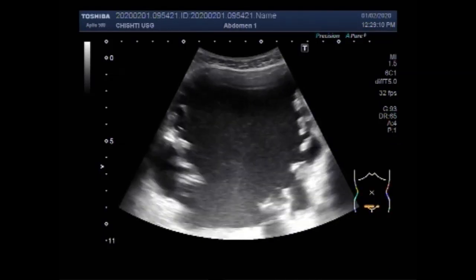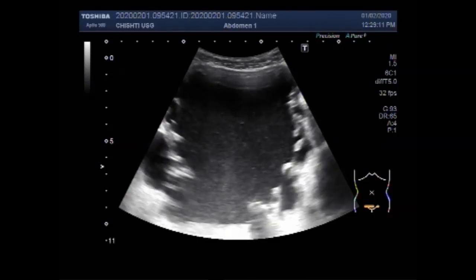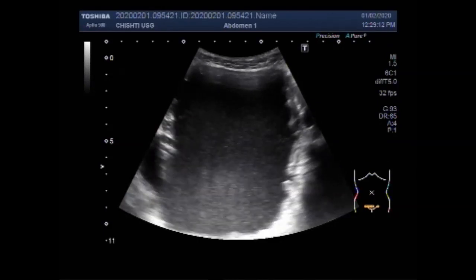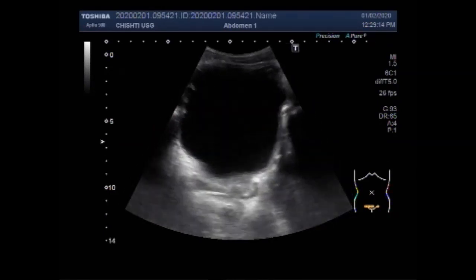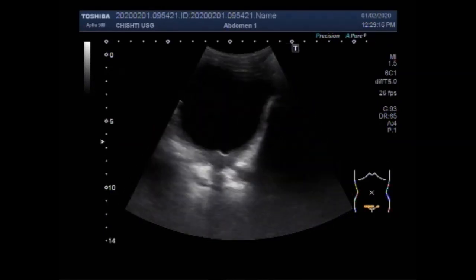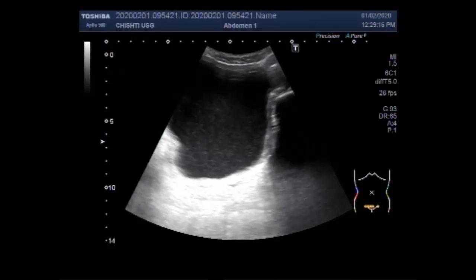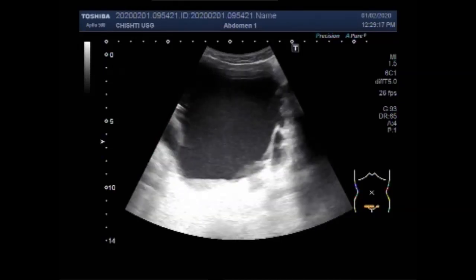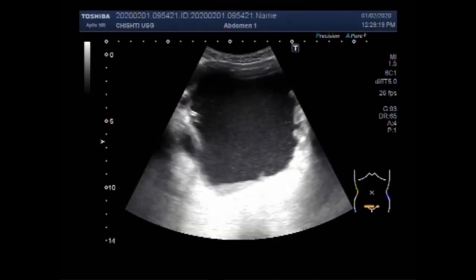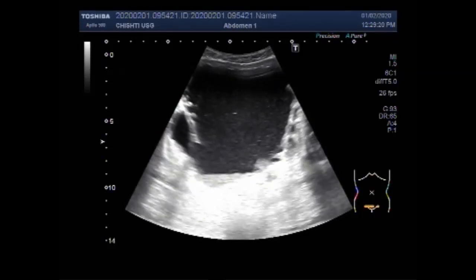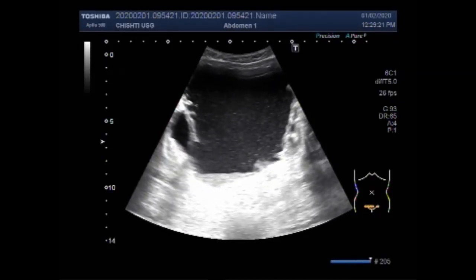Now you can see the urinary bladder, and thick sludge is seen in the urine present in the urinary bladder.